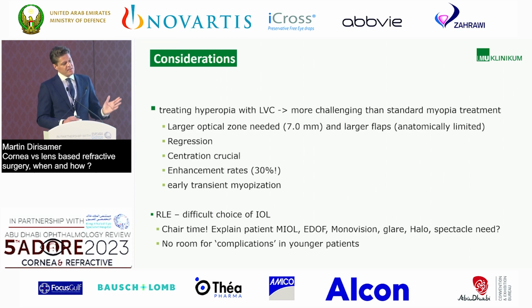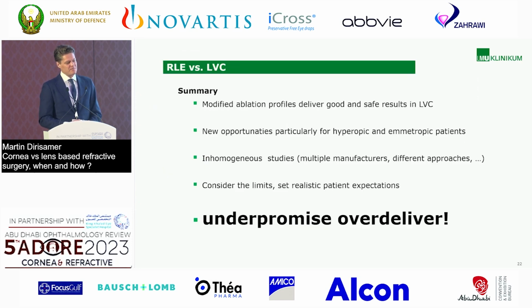For the refractive lens exchange, the choice of IOL is very difficult, but we will hear some talks later, I think, sharing time to explain all the different kinds of IOLs we are dealing with. Sorry, Shiraz, I put the multifocal EDOF classification here, but you will make it clear afterwards. And there's no room for complication in younger patients.